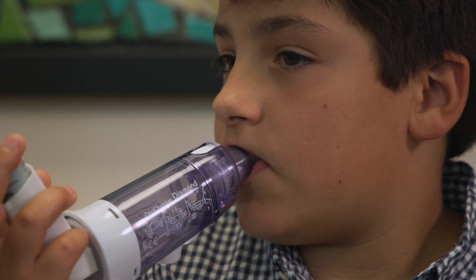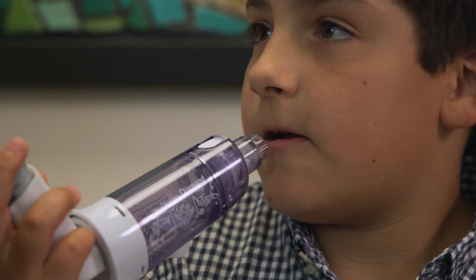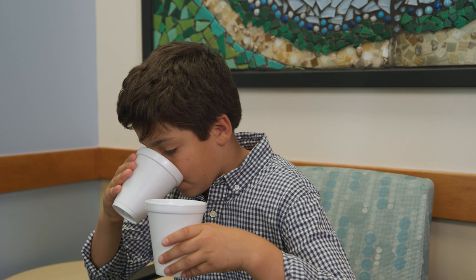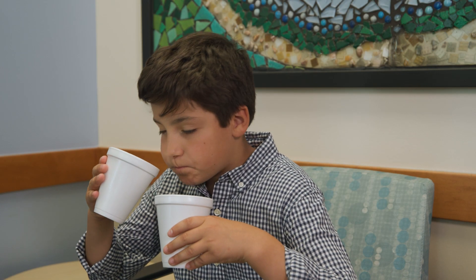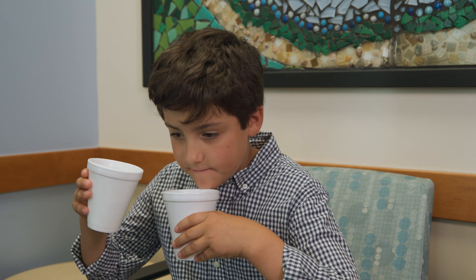You have now completed one puff. Wait one minute, and then repeat these steps until you have completed the prescribed amount of puffs. If you are taking an inhaled steroid, you will want to rinse your mouth after the treatment. Be sure not to swallow the water, but spit it out.